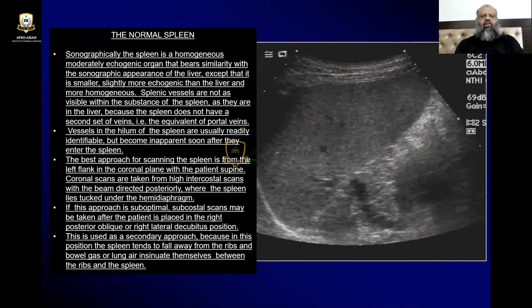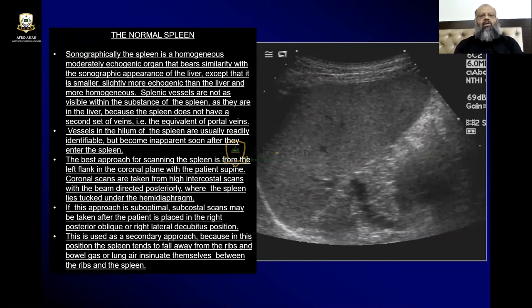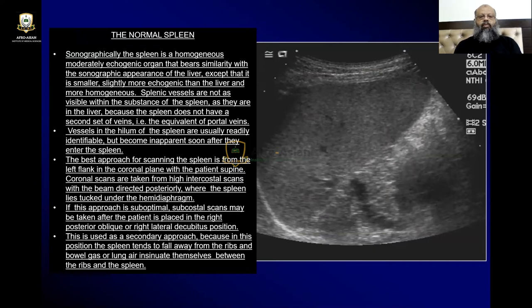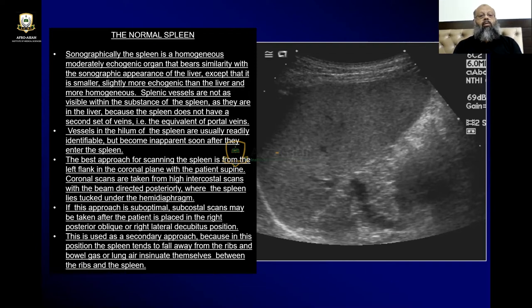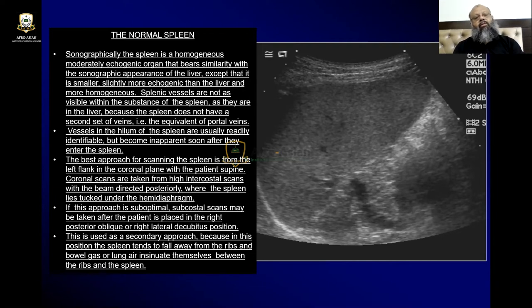Sonographically, the spleen appears as a homogeneously moderately echogenic organ that bears similarity with the sonographic appearance of the liver, except that it is smaller and slightly more echogenic than the liver — so it is a little bit hyperechoic compared to the liver and more homogeneous. Splenic vessels are not as visible within the substance of the spleen because the spleen does not have a second set of veins equivalent to the portal veins. Portal vein walls are echogenic and are more prominent.